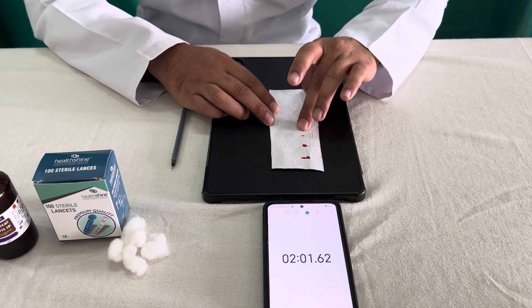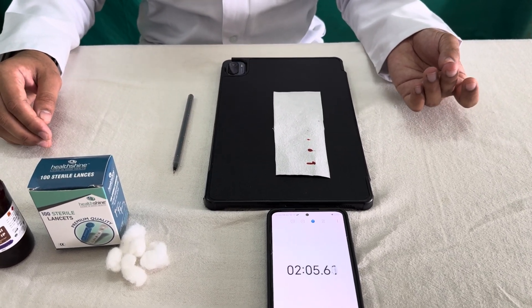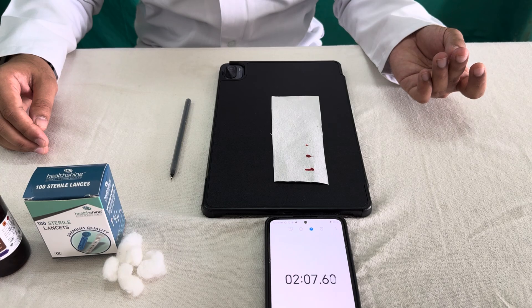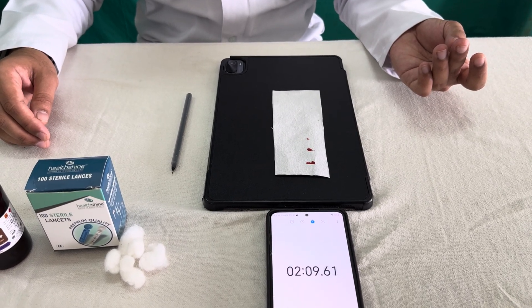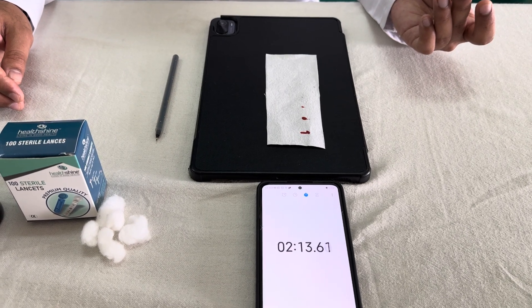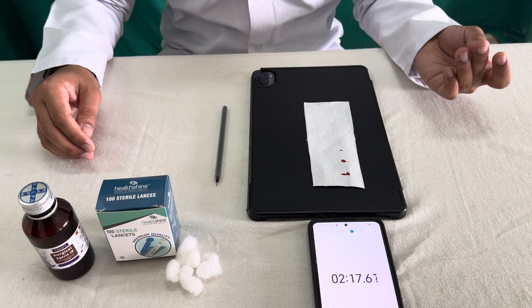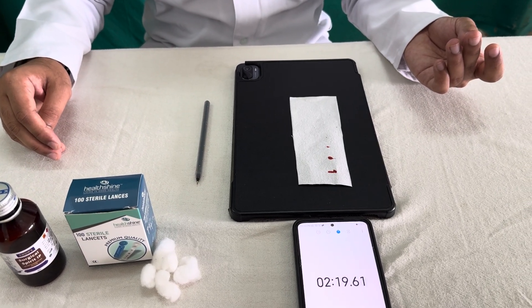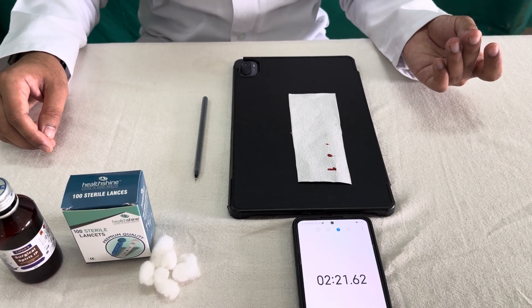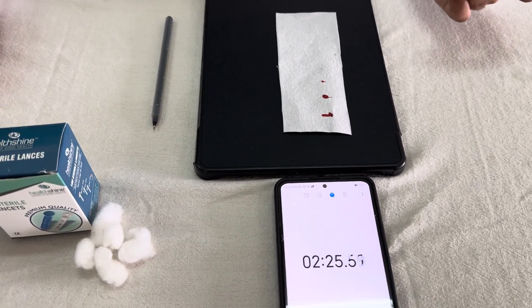This is the 2-minute mark. As you have seen, every 30 seconds we touch the finger with the blood drop on the blotting paper. Finally, we will wait again and for the next 30 seconds we will try to touch it. We will stop when there is no blood drop or blot seen on the blotting paper.